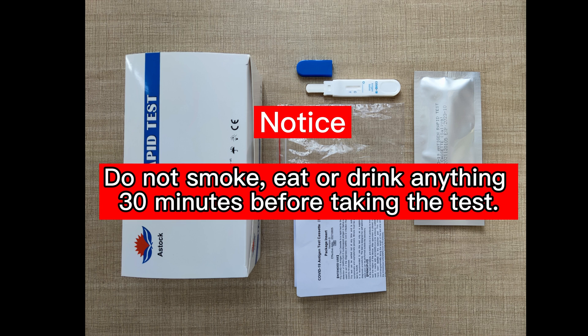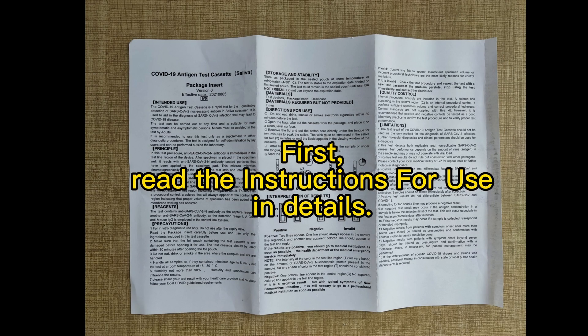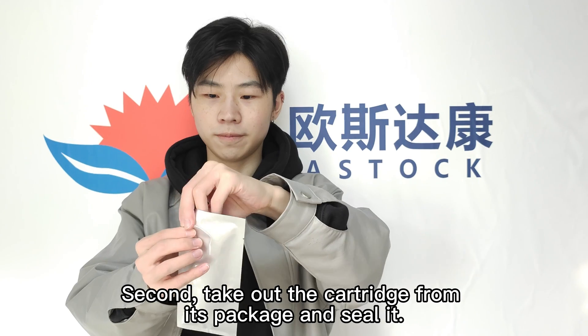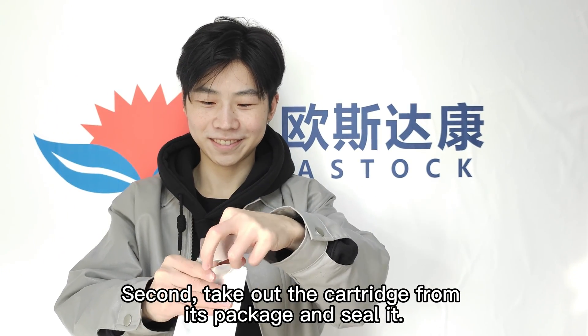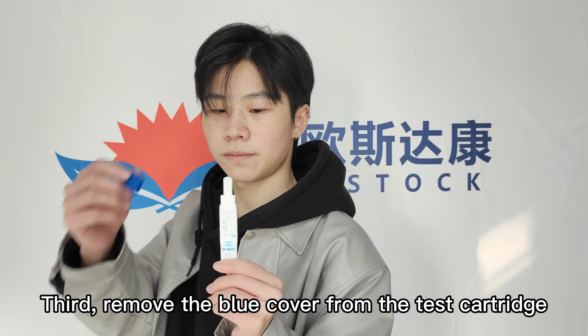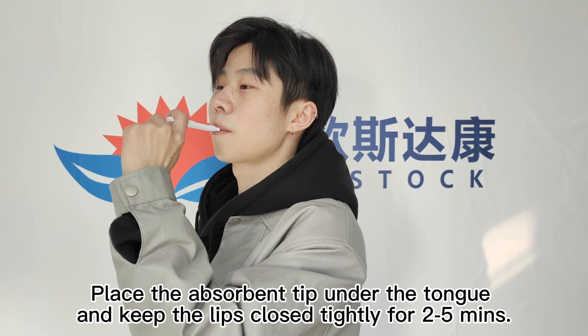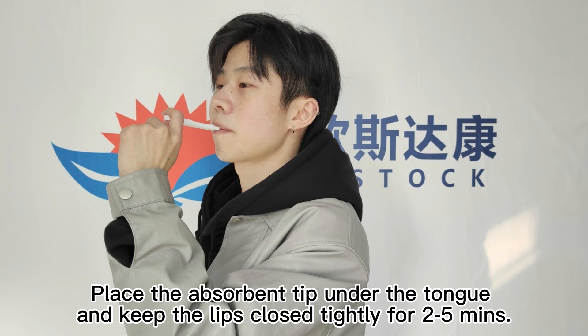Do not smoke, eat, or drink anything 30 minutes before taking the test. First, read the instructions and details. Second, take out the cartridge from its package and seal it. Third, remove the blue cover from the test cartridge. Place the absorbent pad under the tongue and keep the lips closed tightly for 2 to 5 minutes.